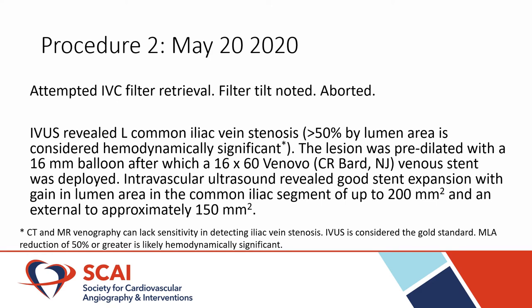IVUS revealed a left common iliac vein stenosis. The lesion was predilated with a 16mm balloon, after which a 16x60 Venovo venous stent was deployed and post-dilated with the same balloon. Intravascular ultrasound revealed good stent expansion with a gain in lumen area of up to 200mm² in the common iliac segment and 150mm² within the external iliac vein.